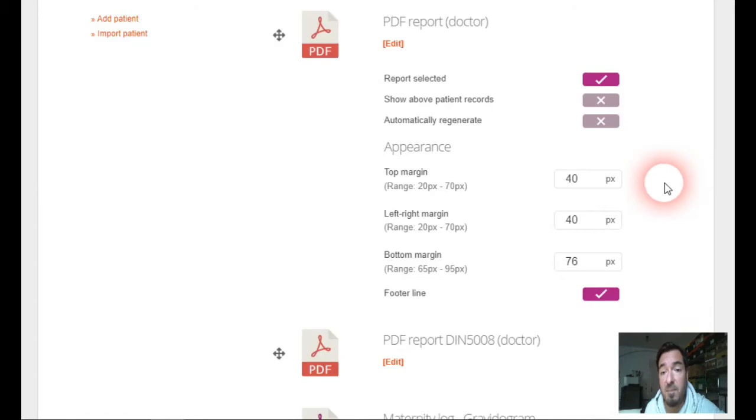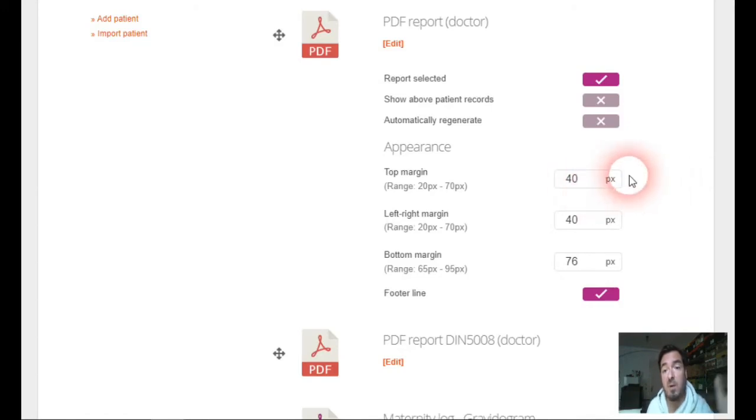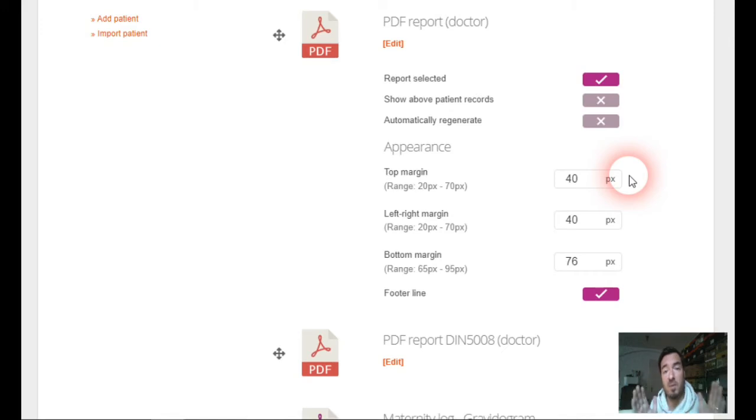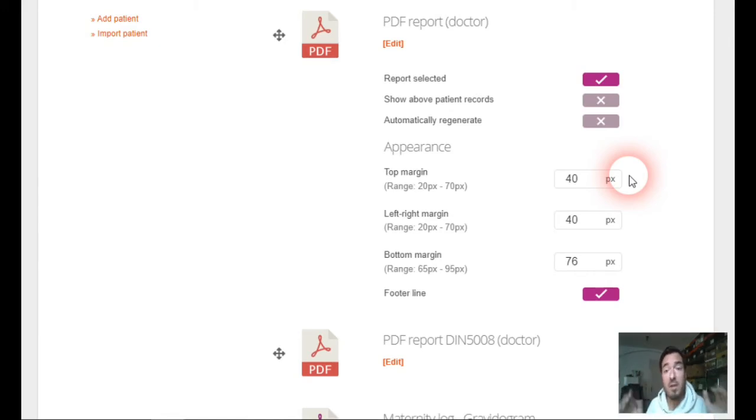you can set up margins of the report. So you, by yourself, can choose if the report will be narrow or wide according to the settings of your printer and everything.